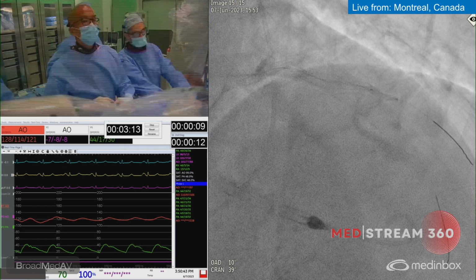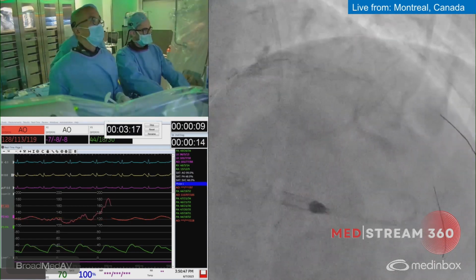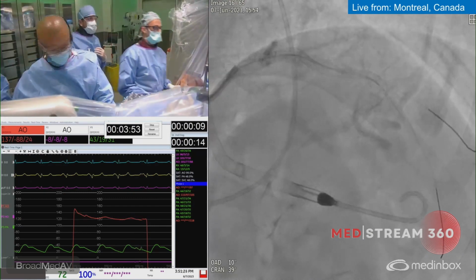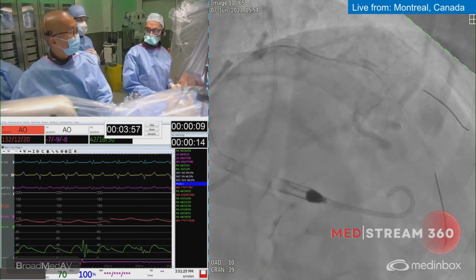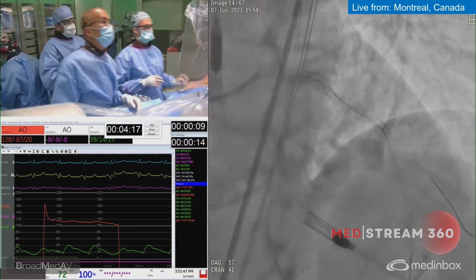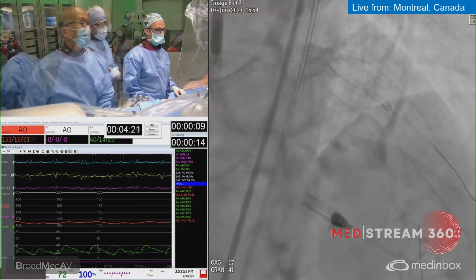Okay, so we'll do less than 30 seconds. All right, let's do this and see. Oh, actually, do you want to do a drug-eluting balloon? What do you think? Maybe do an LAO cranial? Yeah, that's where I'm already headed. Small. Yeah, I'm not unhappy with this. I would tend to leave this. Yeah, let's leave it.